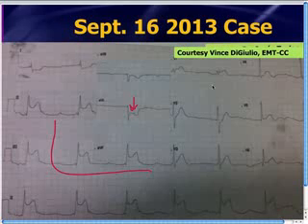So in this particular case, the STEMI didn't go away. The patient still needs treatment with cath or lytics. And so the lead misplacement here didn't really make any difference, except that it's nice practice to pick up lead misplacement. All right. So my thanks to Vince for correcting us, pointing out that mistake that we missed.